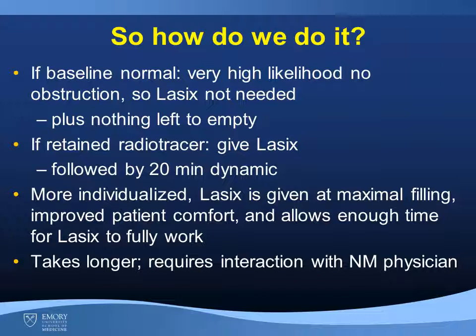Now this technique is more individualized. Lasix is given at maximal filling. There's also improved patient comfort and it allows enough time for the Lasix to fully work. But this also takes longer and requires more interaction with the nuclear medicine physician.